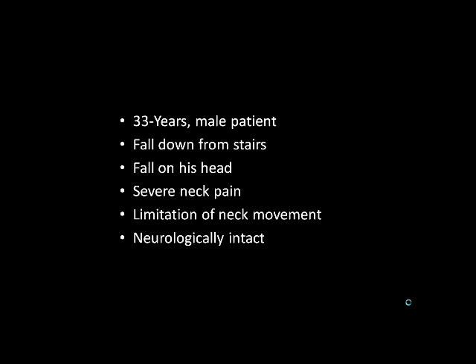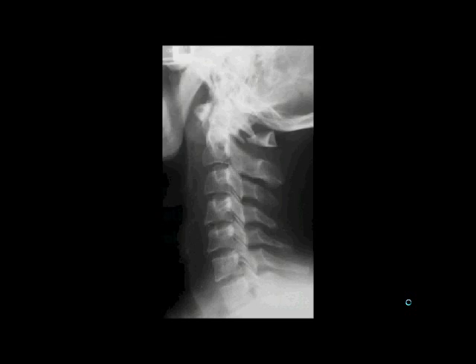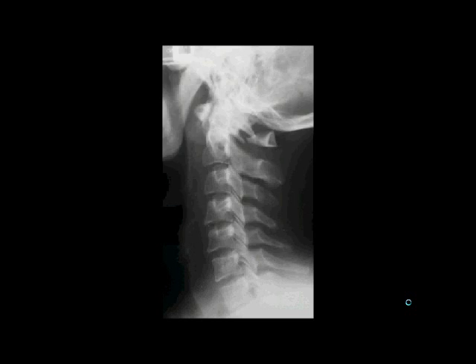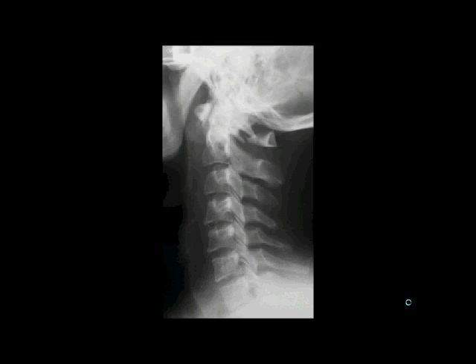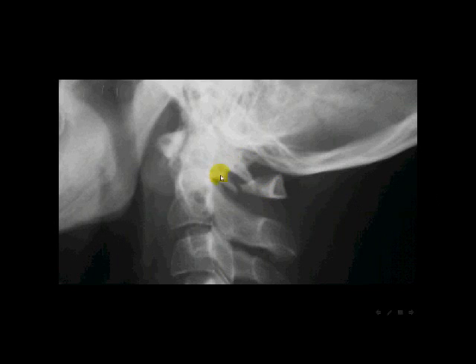Neurological examination revealed no abnormality including motor, sensory, and reflexes. The patient was seen first by the general practitioner in the emergency room where a plain x-ray of the cervical spine was passed as normal, but when the neurosurgeons came to the emergency room they looked very carefully and it was clear that the C1 posterior arch is disturbed.